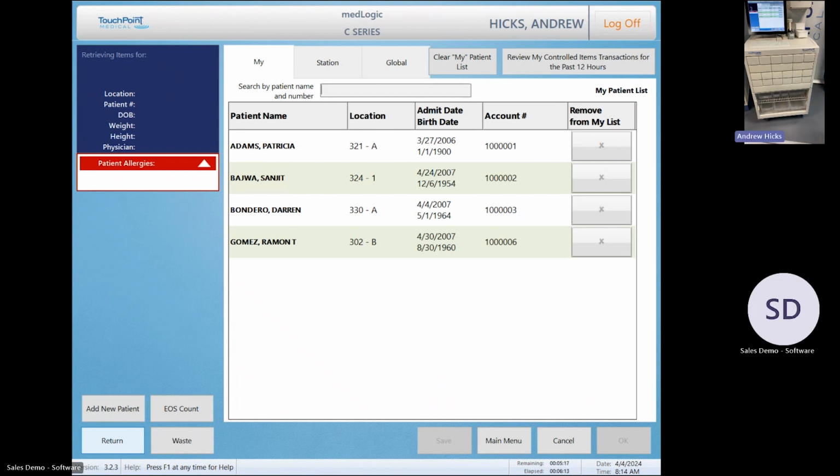There are smaller and larger units in this too. This is kind of the middle of the road size. There is a base 12 countertop unit, which you can think of as being cut off right here at these top two rows. So it can have up to 12 drawers. There's also a base 60, a larger unit. So as you can imagine, it has 60 drawers all the way down to the bottom. There's also a base supply unit. So it would have the clear door top and bottom in here. So it'd have two doors in it. So again, we call that a base supply. Those are the four base units.